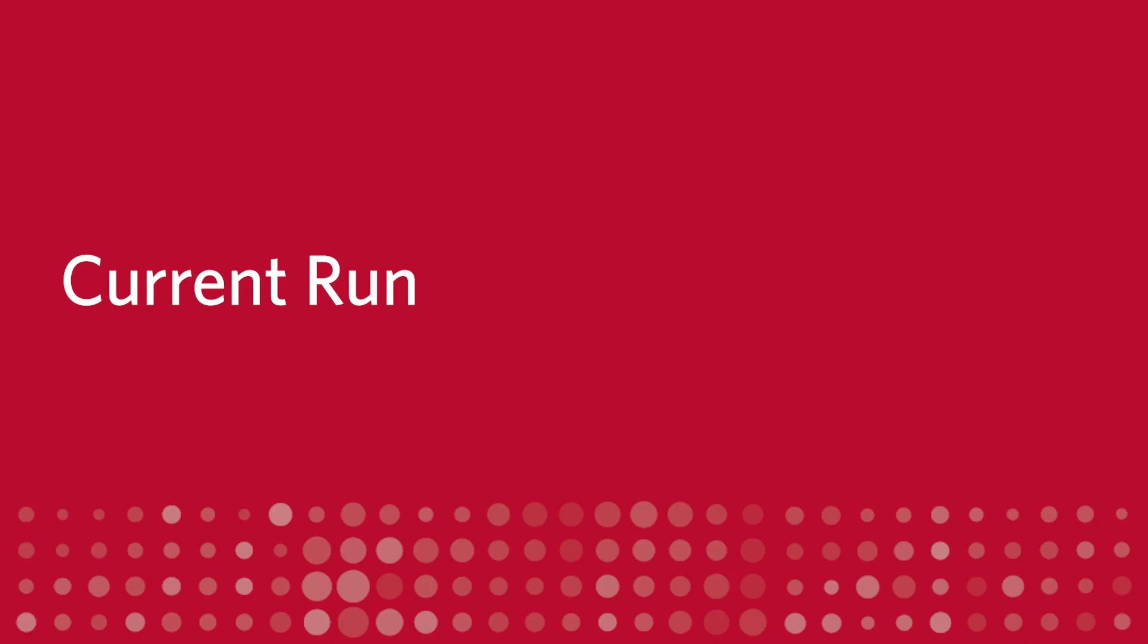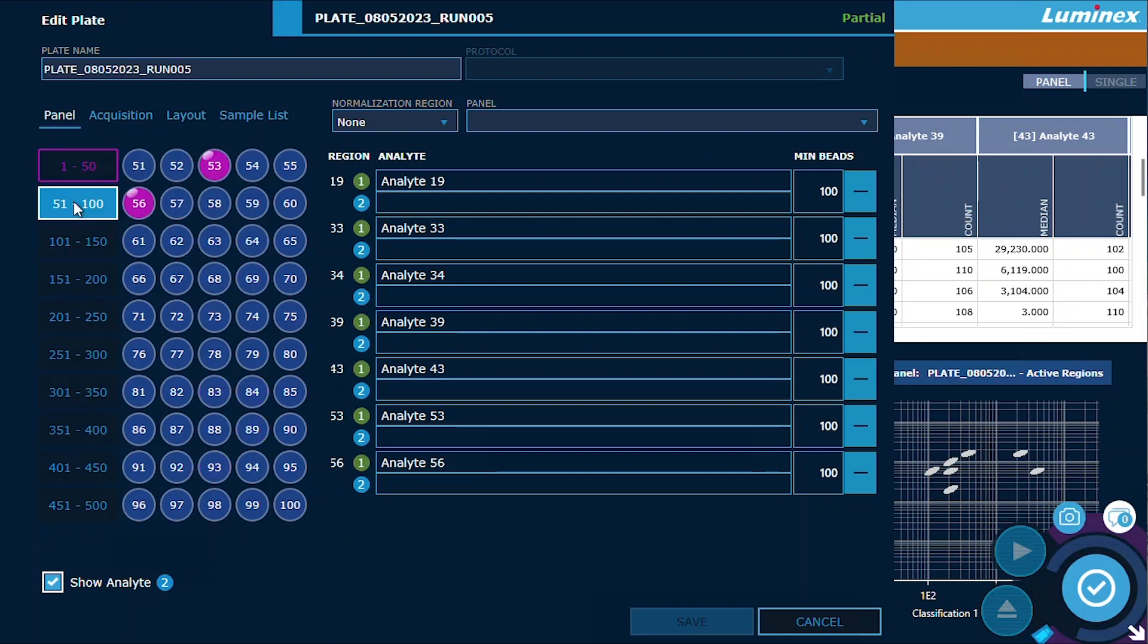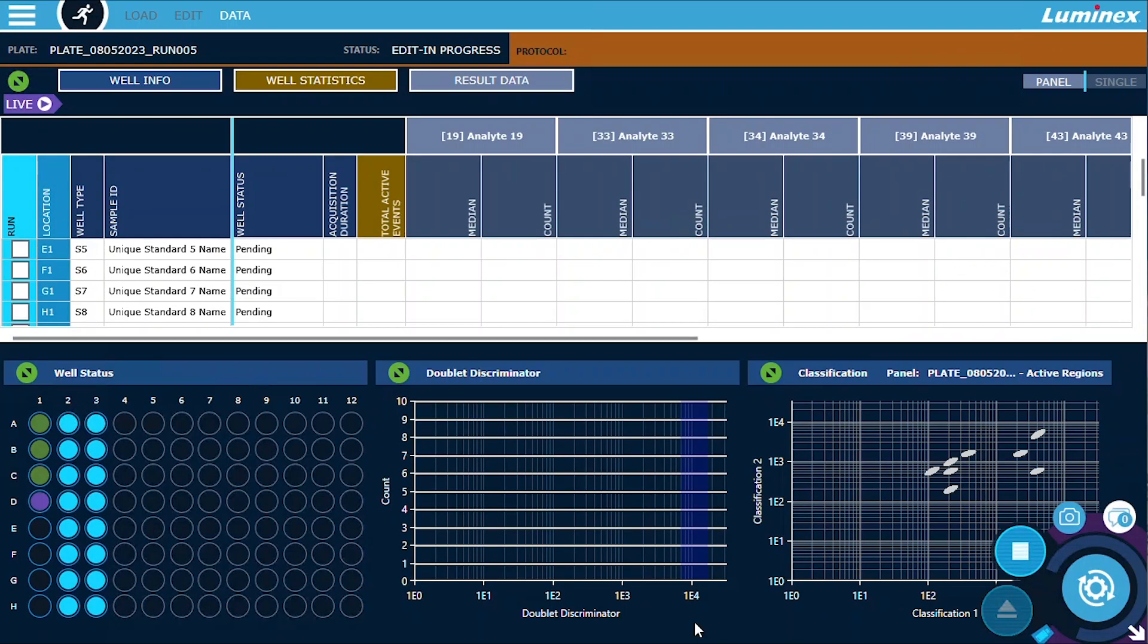Current Run. We've also introduced editing capabilities during a plate run on the Current Run page. This new added convenience allows for reanalysis in the middle of a run, enabling you to quickly adjust settings without restarting the process.